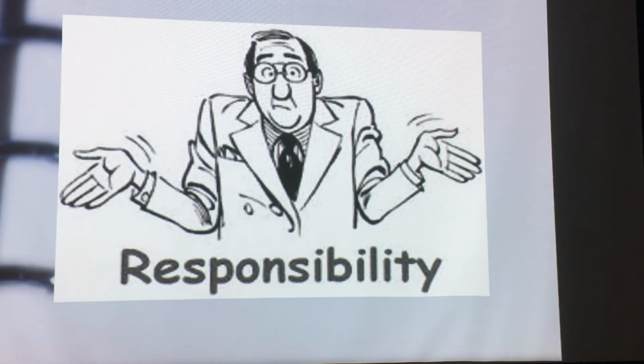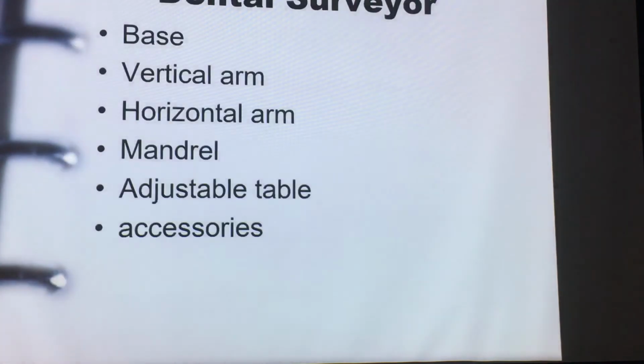Although, we can go even further, as many laboratories farm out the frameworks of the cast partials to a third party. It's that laboratory's responsibility, but I've seen sometimes that they pass this down to the third party laboratory, and then they're far removed from the treatment plan, and they just make the framework as they see fit. And this is where I've seen some problems occur. It's about responsibility. Even if most laboratories send it out, it's their job to communicate the design to the practitioner or even survey the model.